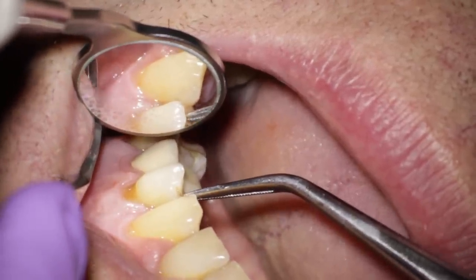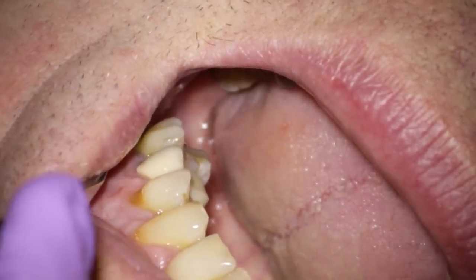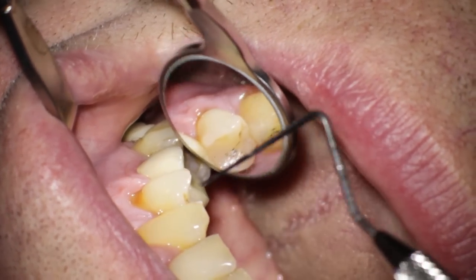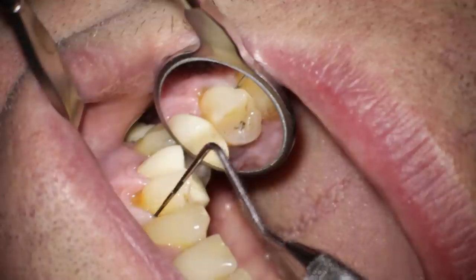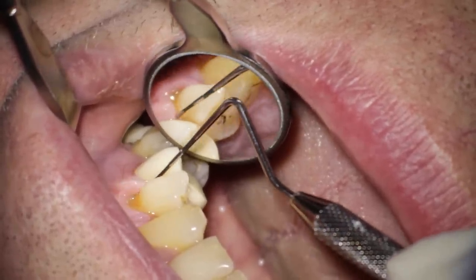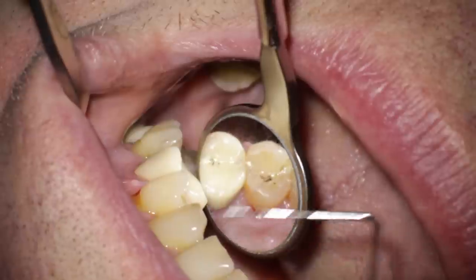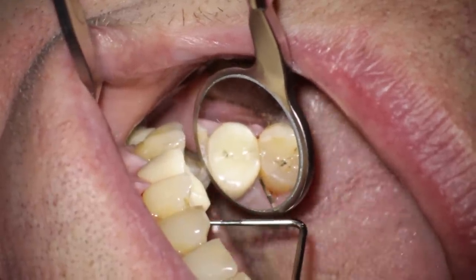The tooth was saved with endodontic treatment and is still in function. The diagnosis also has to be made while probing the pocket depth with a calibrated probe, as you can see here, around the buccal aspect of the tooth surface.